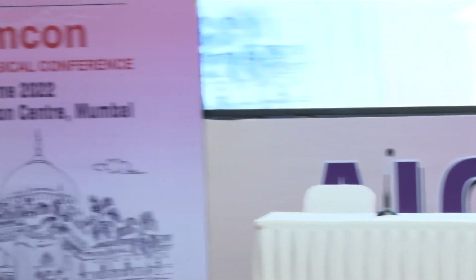So Dr. Shams, are all your children usually with scarred and opaque corneas? Are you thinking of doing angle surgery in the not so opaque ones, to try and avoid the conjunctival surgery? My experience in our country, if I see the intraocular pressure is not too high, the cornea is enlarging, I used to do the B scan, and if everything is fine, sometimes I wait and I don't do the surgery.